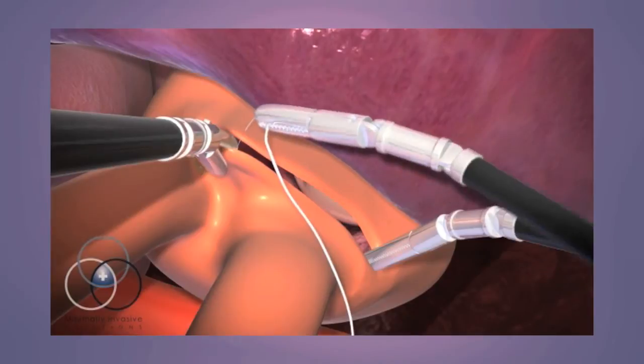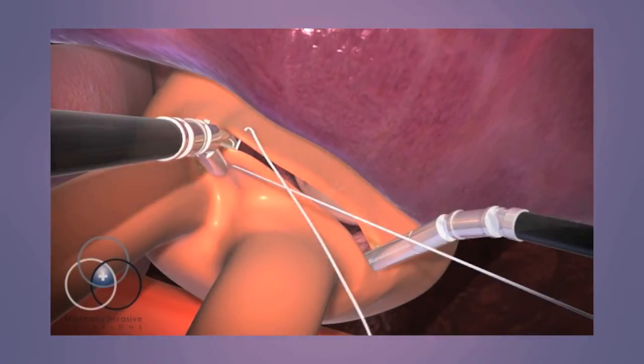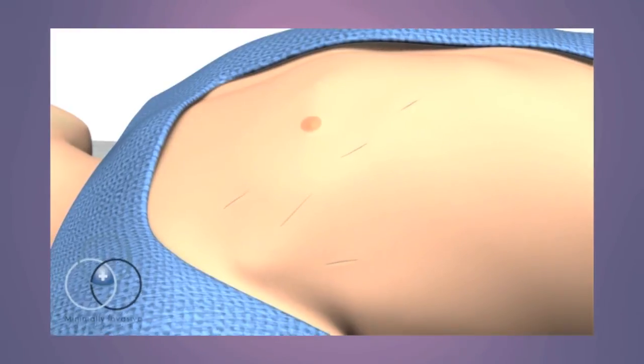Once the repair has been tested, the atrium is closed and the heart is restarted. The surgeon undocks the robot, closes the incisions, and takes the patient off of the bypass machine.